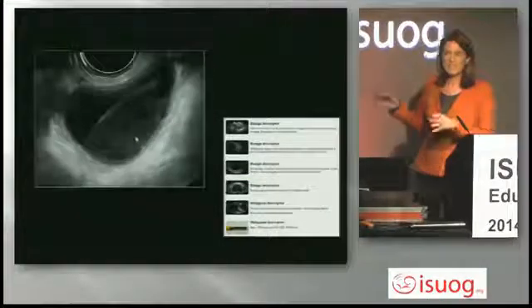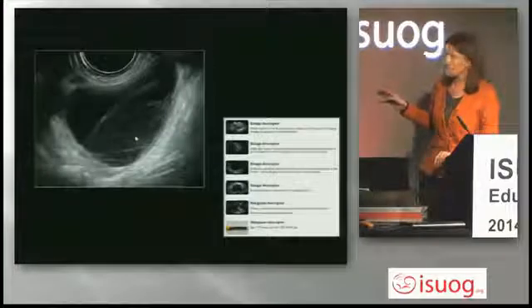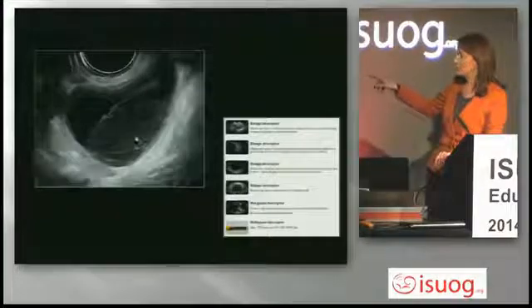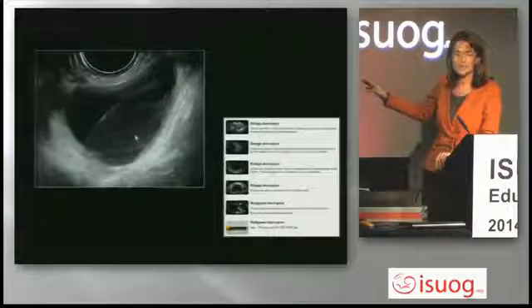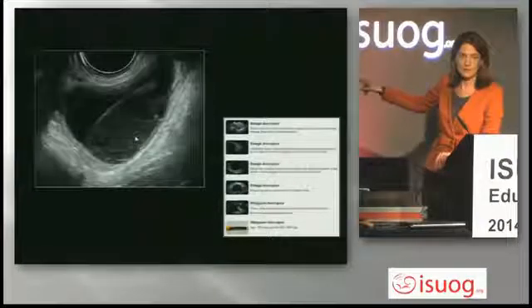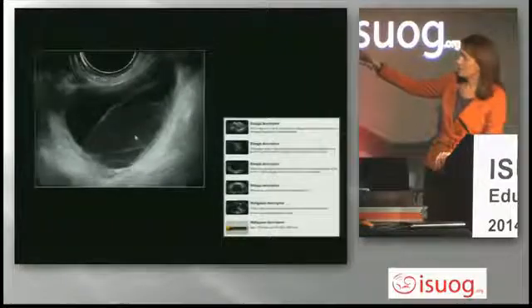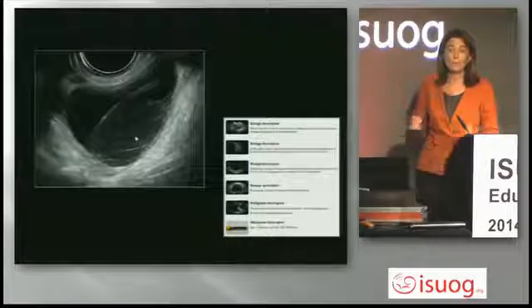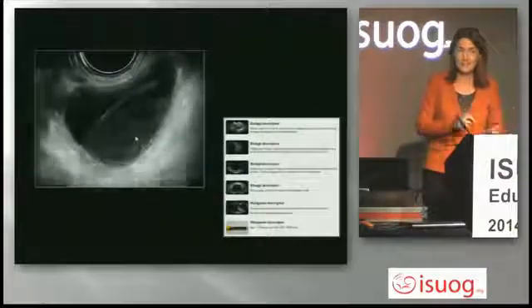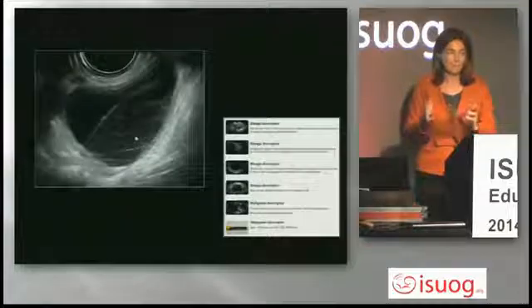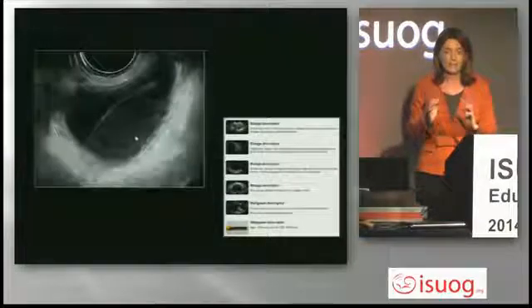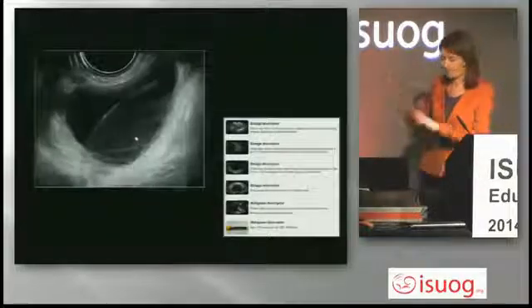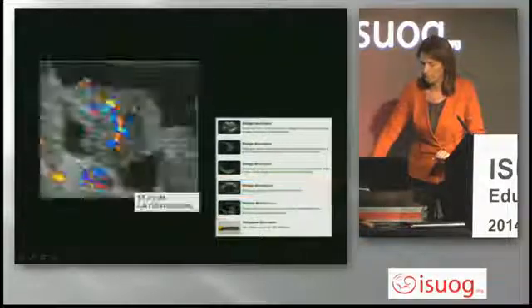The first descriptor is a little tricky: remaining unilocular tumor with regular walls — as you can see, there is no specific diagnosis, only benign. And this one? Of course, a corpus luteum. According to IOTA, it shouldn't be among ovarian masses because in IOTA an ovarian mass is a persistent ovarian mass, not a functional one.